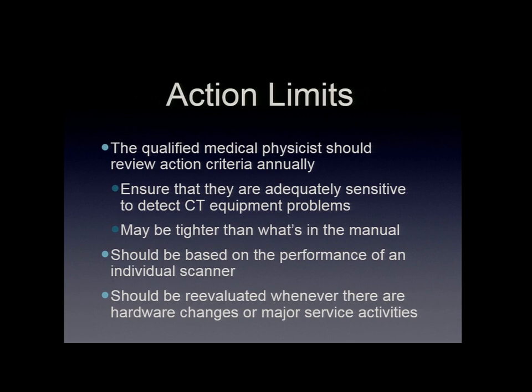And you can make your control values tighter than what they publish in their manual. So evaluate the scanner, see what would work best for that ongoing QC program, so you can get the optimal performance out of that. So you can get optimal images for your radiologists to review.